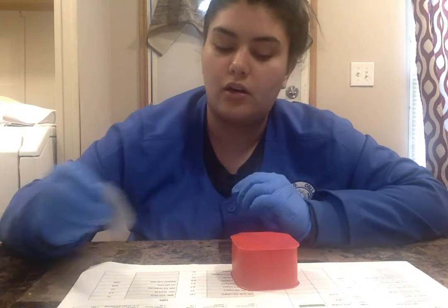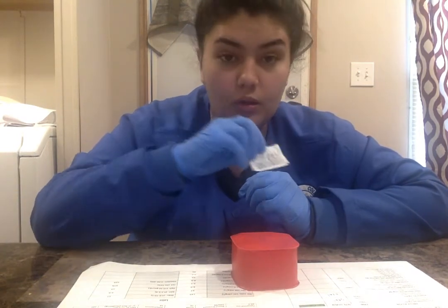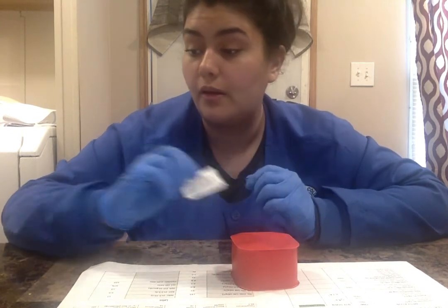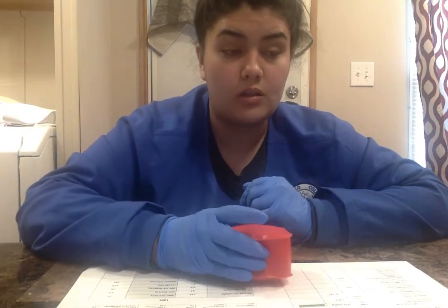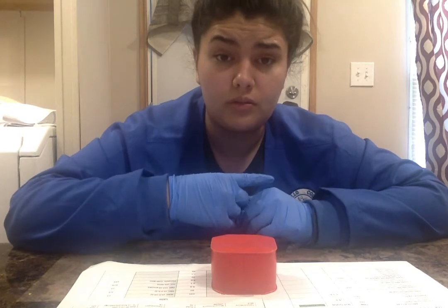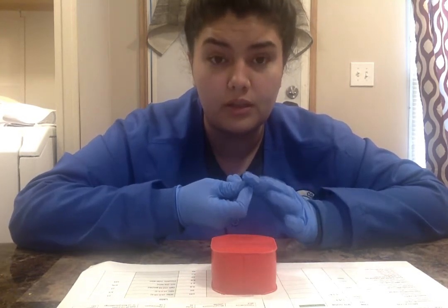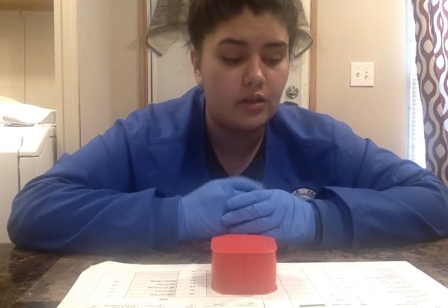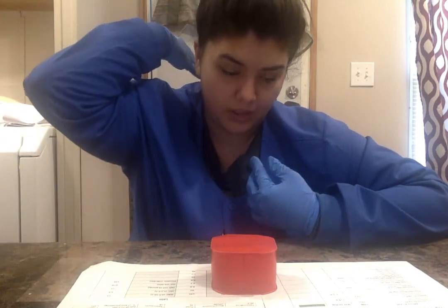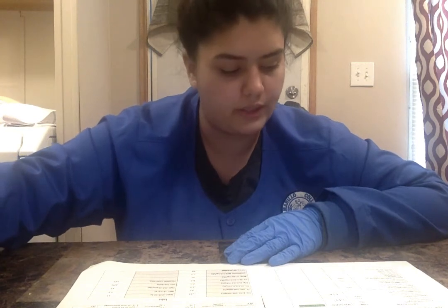And then we take our alcohol swab and we gently swipe if we need to, but we do not rub this medication into the patient. Also, with the intradermal medications, you do not shove the whole needle into the skin. You just barely shove the tip of the needle into the skin. The other intradermal sites are the subclavicular and the scapular area of the back. So we're good to go on that.